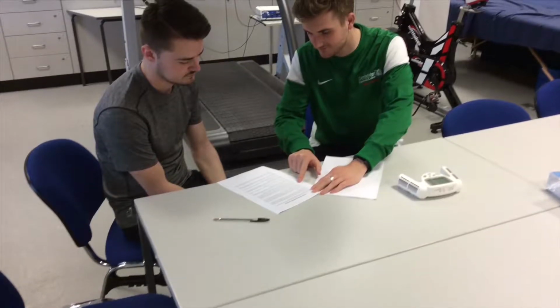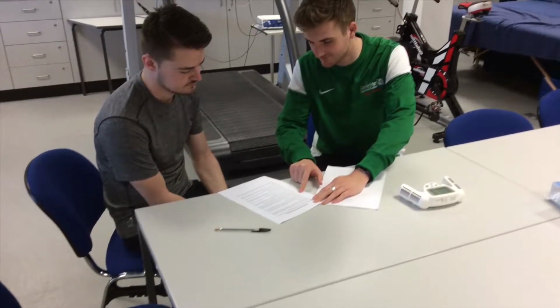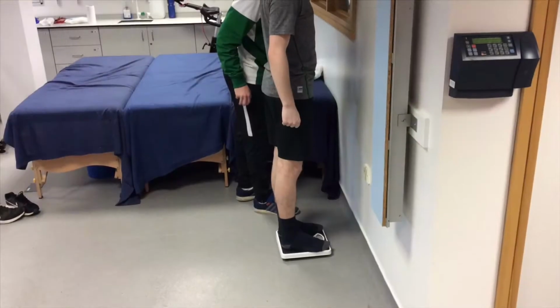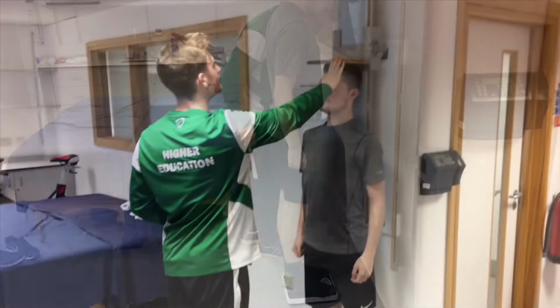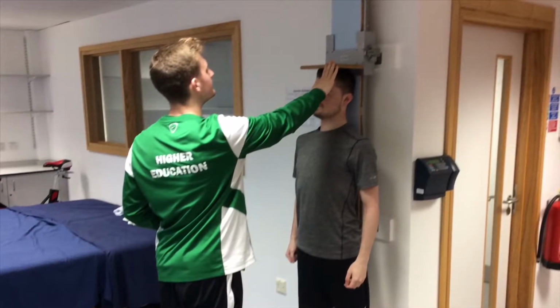The initial consultation is the first stage of carrying out VO2 max testing. This is important as a computer system requires basic information such as height, weight and body fat to work out normative data, which are being carried out as shown.